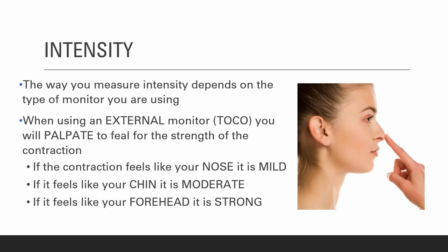And again, when we do external fetal monitoring, it's very, very subjective, even though on tracing it looks like it may be a very big contraction. Everything is a little bit subjective when it comes to the external monitoring. It's not accurate. It doesn't really measure intensity.